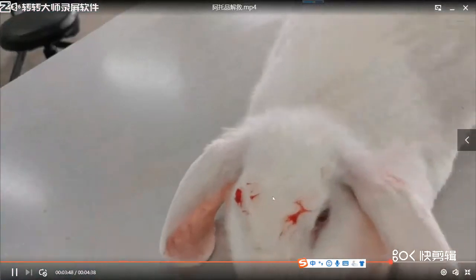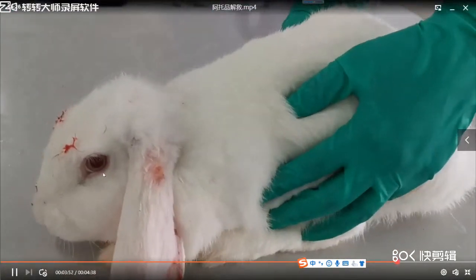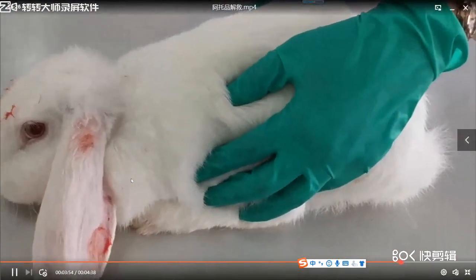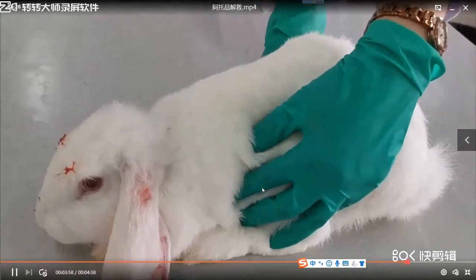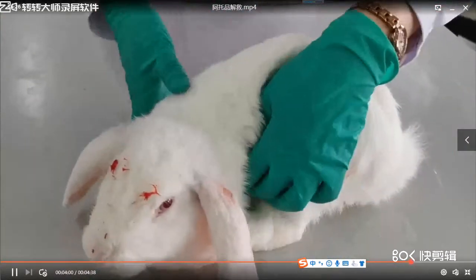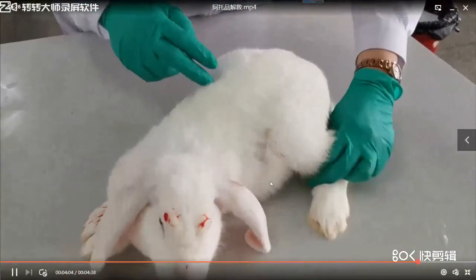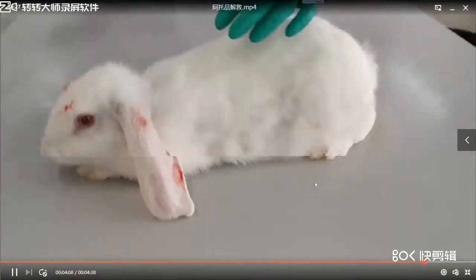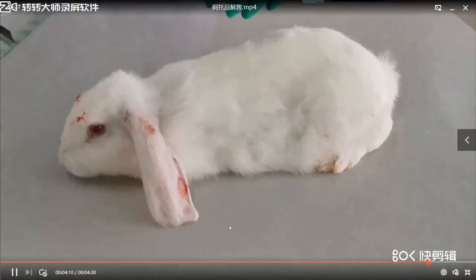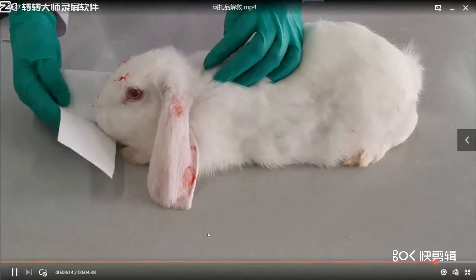The pupil size is larger than before, 12 millimeter, and the breathing rate is increased higher than just now, so maybe 40 times each minute. The muscular tension is normal, and no salivation.